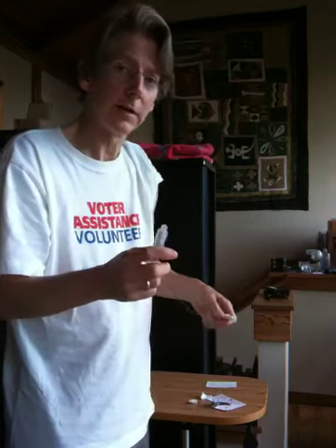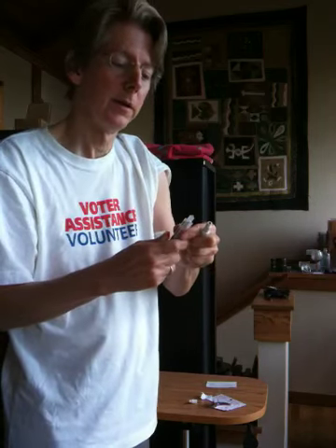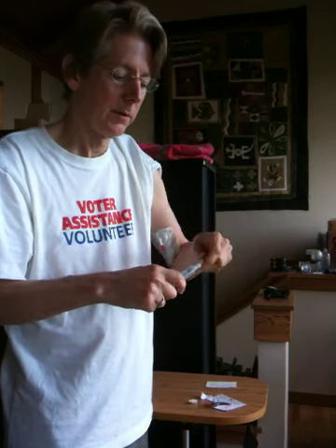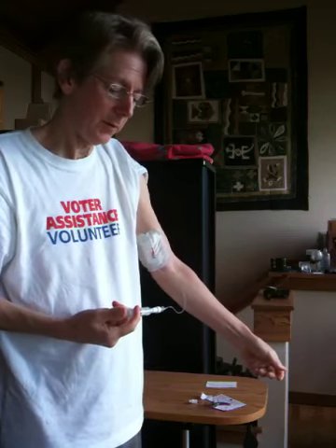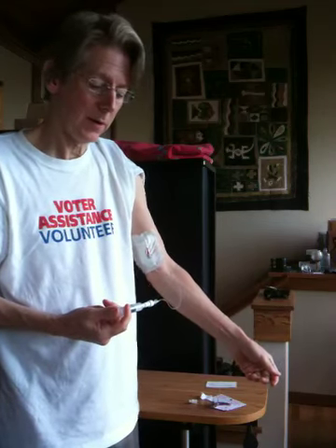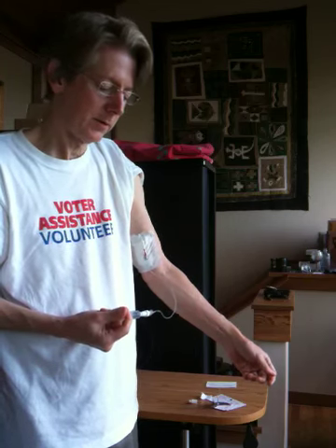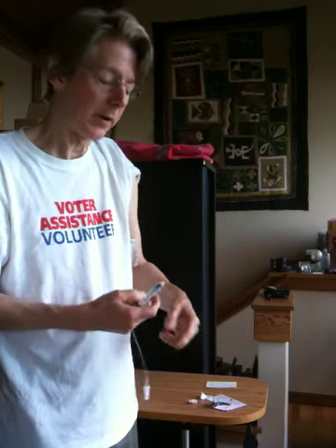This is just saline solution — my nurse is at the door so I'm going to do this quickly. I plug in the saline solution and pump away slowly in little spurts. When my nurse comes up, we'll do part two where we actually pull the line out of my body.